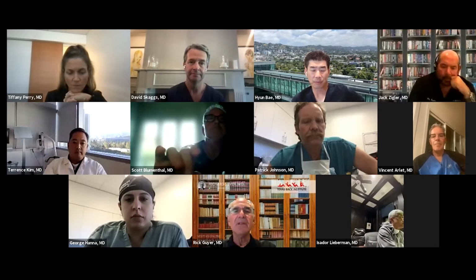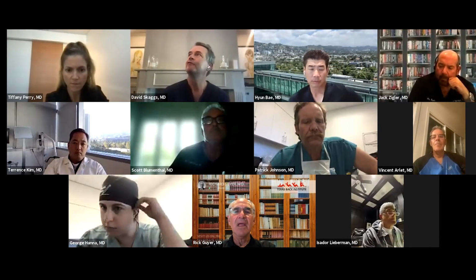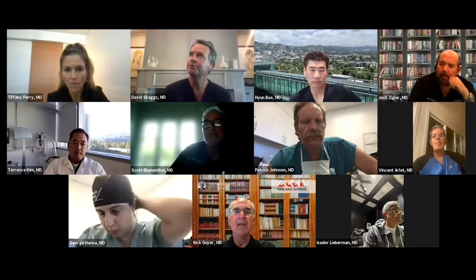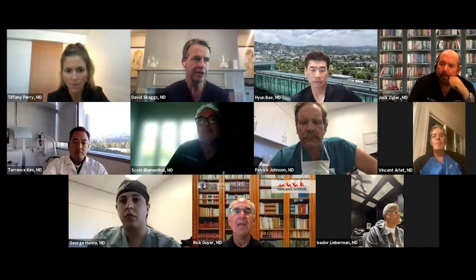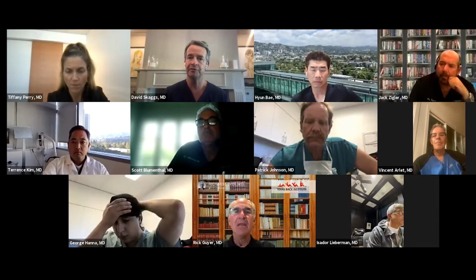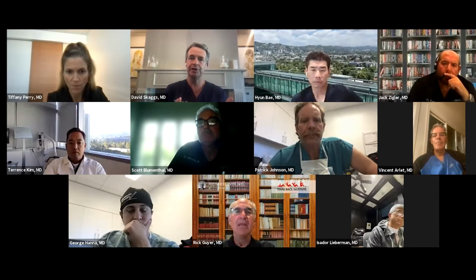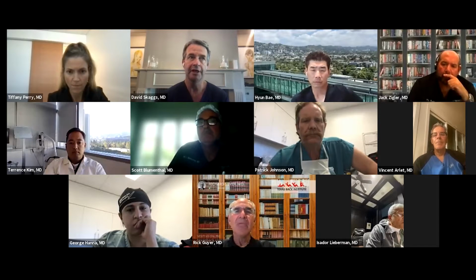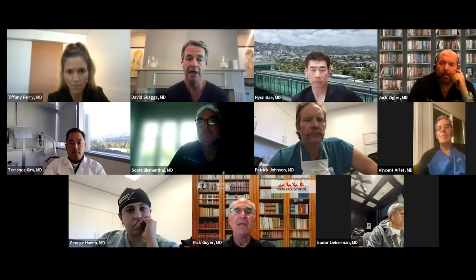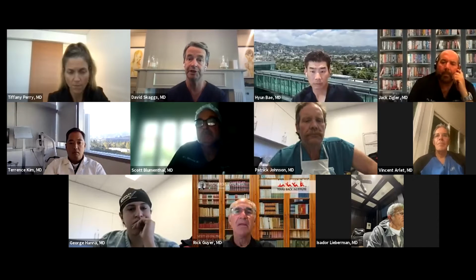And then David, go ahead. What is the learning curve? For about the first 3 years, I didn't tell anyone I was doing it because I didn't want anyone hurting children. Now I have my PGY2 residents, the first week of orthopedic residency, put in screws on the first patient. The learning curve is we sit in my office together, they do it on a model, and then they do it on a human. And honestly, almost every resident puts in screws, and the success you saw, those 22,000 screws, were including residents putting them in.